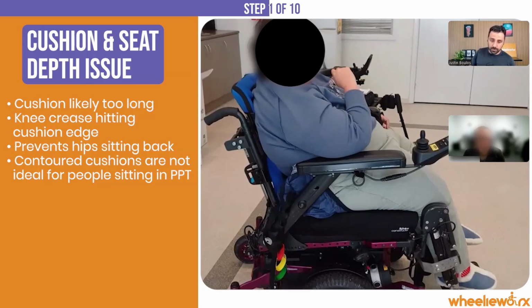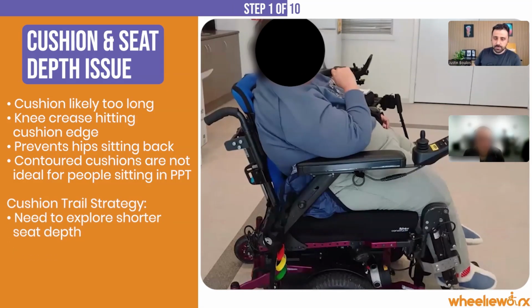Yeah. So what I would do if I was in this situation, do you know what size cushion that is? I think it's a 22 maybe. Wide or long? Wide. And then I think it might be an 18 or a 19 long depth. Okay. Let's assume it's 18 long. This is going to be hard because they're not going to have a cushion this size. But ideally, she's very small. I know, I can tell.